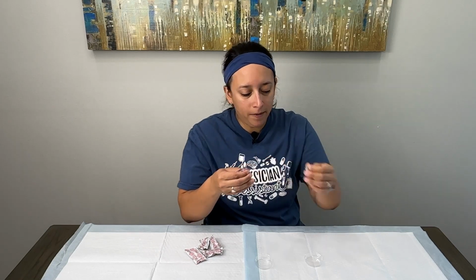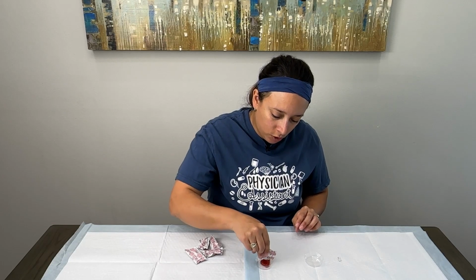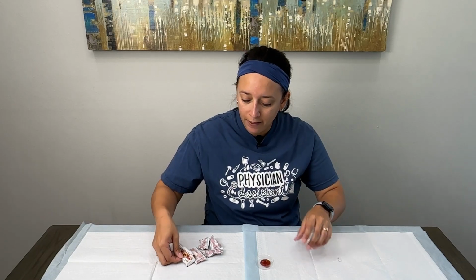I'm going to open it up, and I'm going to squirt some ketchup in there. I don't want to put too much so it's going to come out, but I do want to put enough so that it creates that subungual hematoma effect.